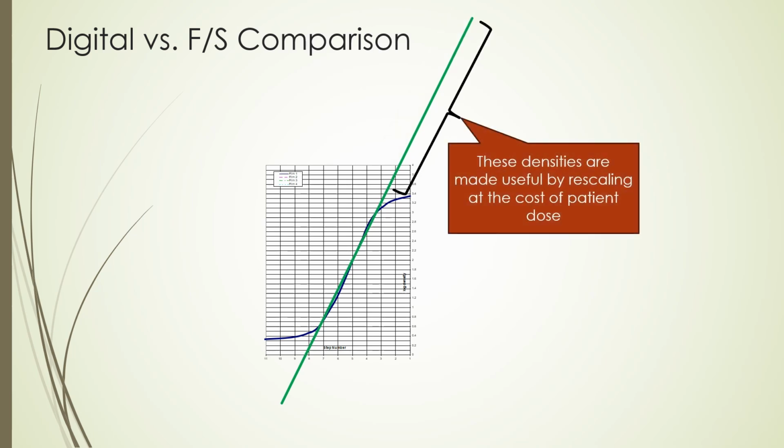In a film screen image, this amount of radiation at the top of the curve would display as uniformly black. But thanks to the process of computer image correction, this image can be saved. There is enough contrast visible between the steps for the anatomy to be distinguished by the computer, and the density is reduced to acceptable levels using an image correction algorithm.